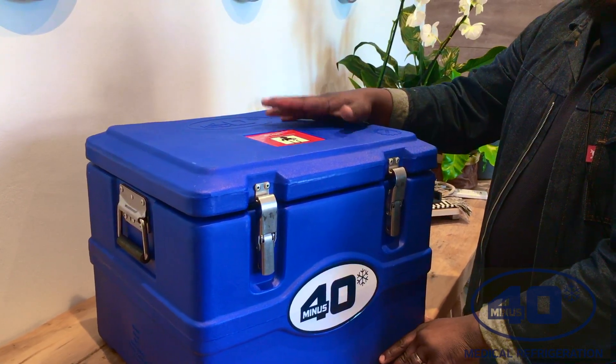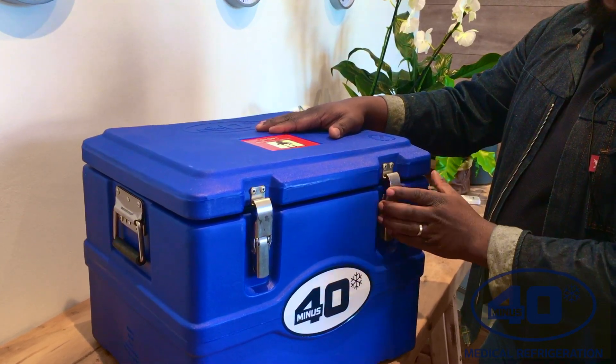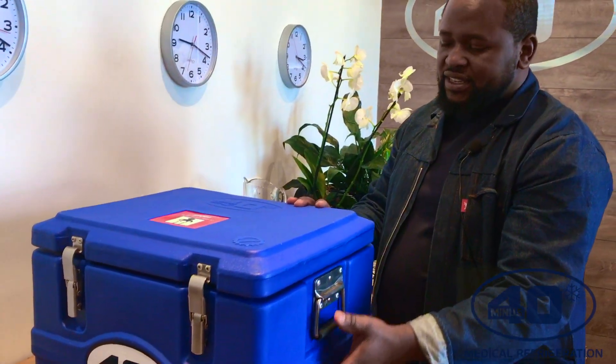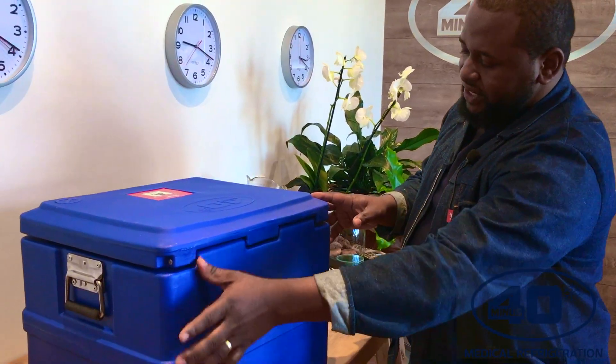And there's also a stop sign — do you need to open it? This is just a safety sign, a warning sign, because you don't want to open the vaccine box unnecessarily. We also have another handle right on the left-hand side, and then we also have our hinges right at the back.